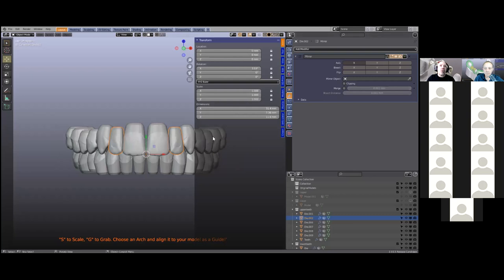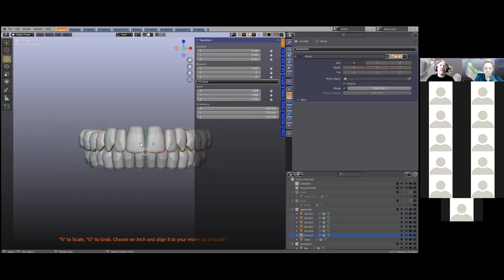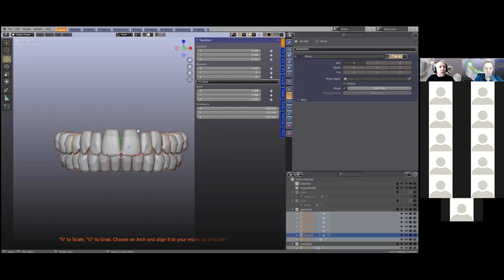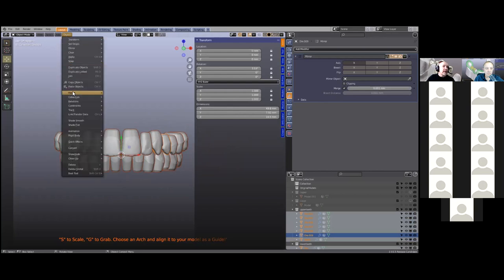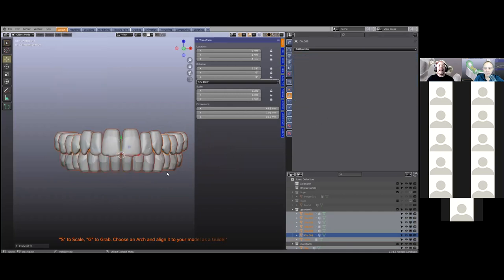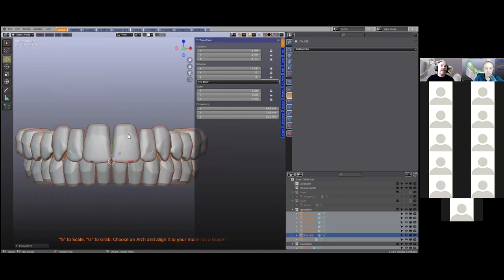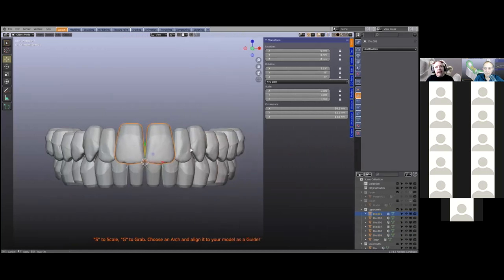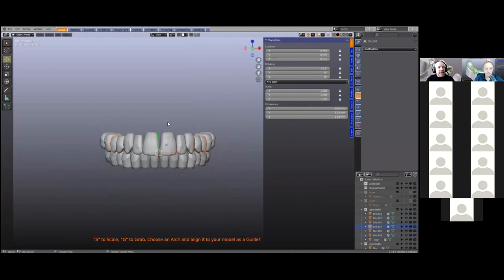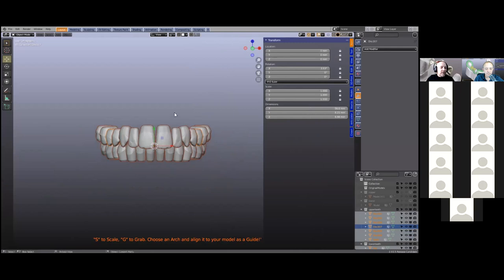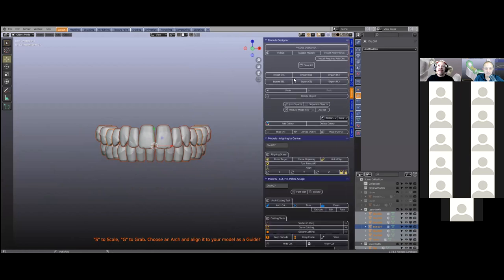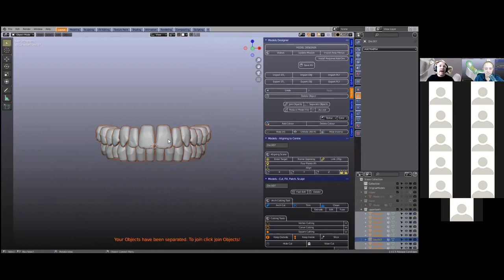I'm going to apply all of this mirror modifier. Here's a trick: we're going to select all — A to select all — go to object, and we're going to go convert to mesh. When you do that, it will apply all the modifiers on each single object. You can see none of them have modifiers on it. Now these teeth are still connected — I want to disconnect them. So A to select all, and we're going to go control J to join, or simply find the join button on the model designer, and then we're going to separate this. Now they're all individual.